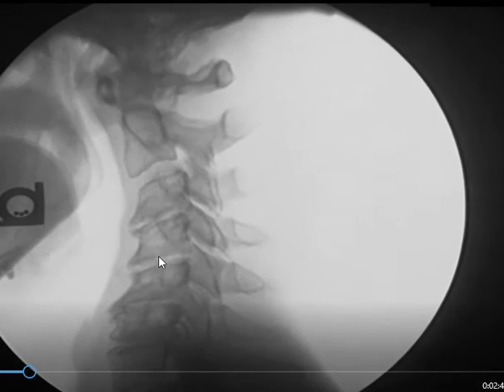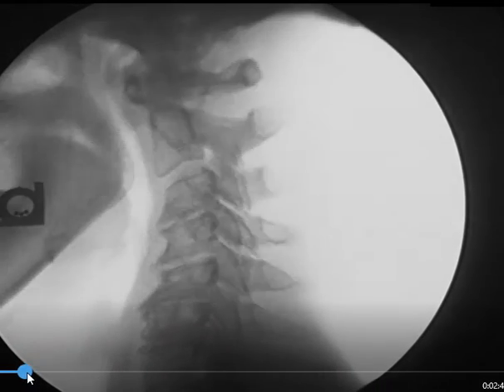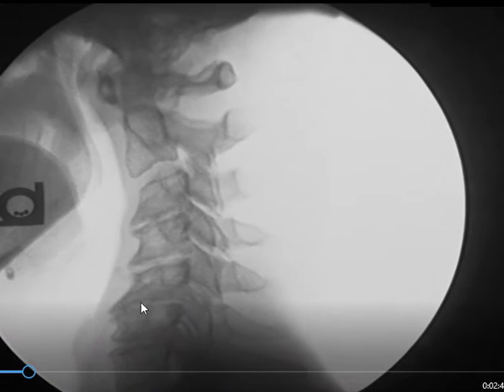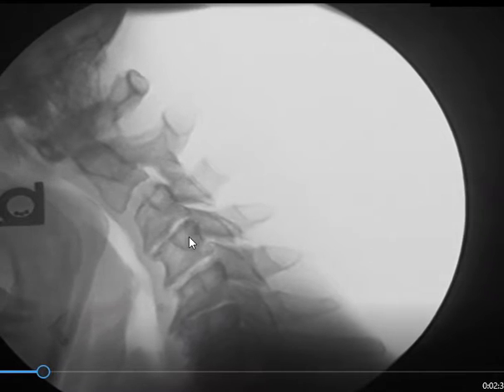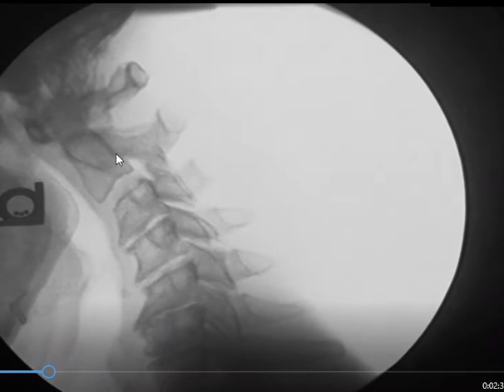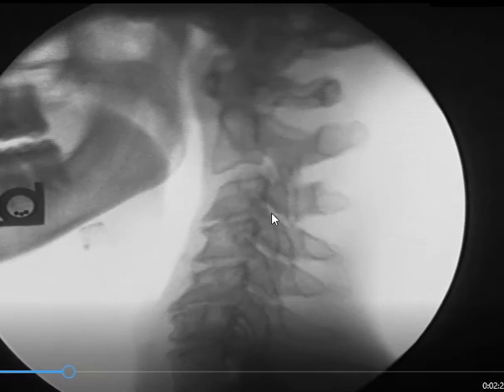Look at this severe kyphosis. Watch the normal neck shape and then you'll see significant degeneration due to the kyphosis causing bone remodeling. Also note the mid-phase movement — there's a pretty large ADI space of the transverse ligament. We're going to focus on how this actually moves.